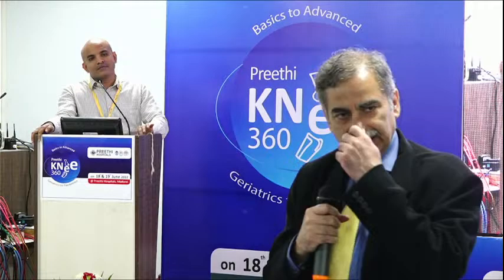Thirdly, you saw an example where the implant was removed. He showed an example of hardware when there was an indication for stem. So all hardware was removed and a stem was put in. Sometimes we just leave the implant inside and take out a few screws and put the normal knee in order to avoid prolonged surgery. But then we know that if you put implant, subsequent surgery becomes difficult. Also, in the knee replacement, the rates of infection are much higher in a previously operated knee compared to a primary.